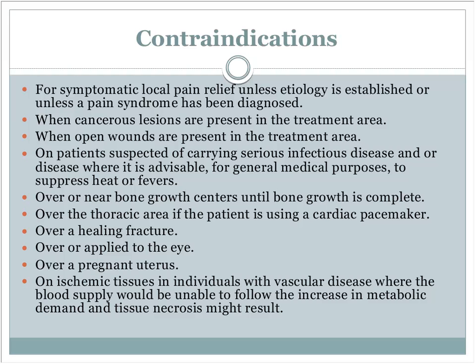It's so easy to transmit something from one patient to another in this regard because we use the same ultrasound head for all of our patients. We don't have different ultrasound heads for different patients because that's just way too expensive.